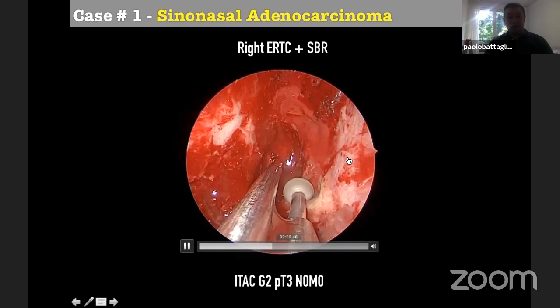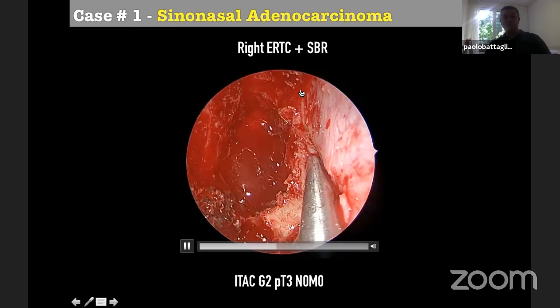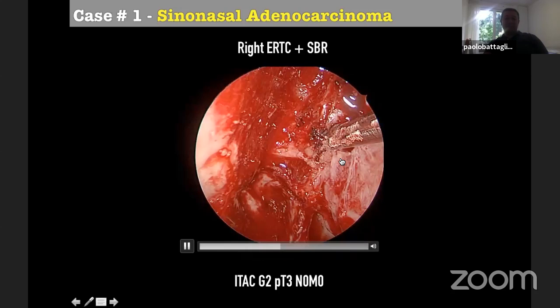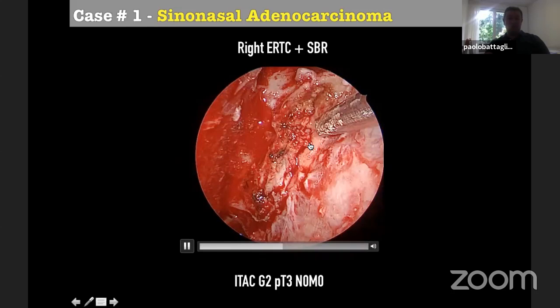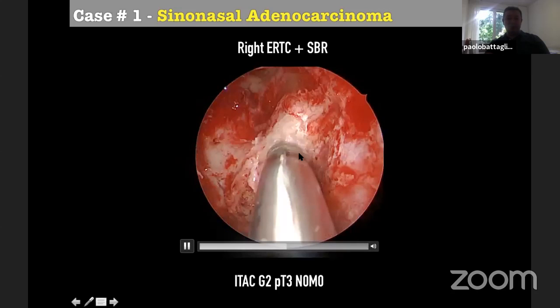Okay, and as you can see here, we drilled and removed the septum, the mucoperiosteum of the right side, the quadrangular cartilage, the vomer and the rostrum. So we expose the olfactory cleft over here, and we expose the crista galli.